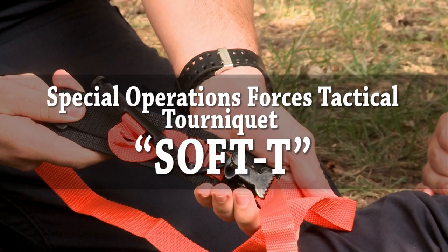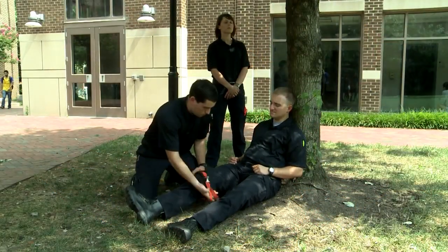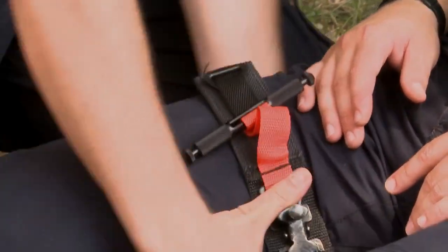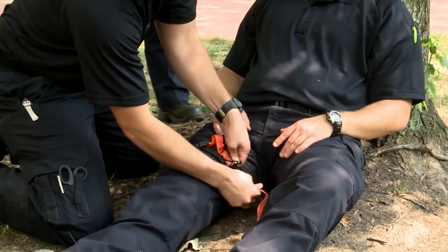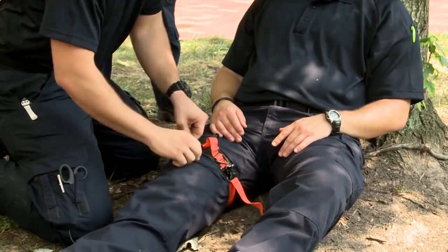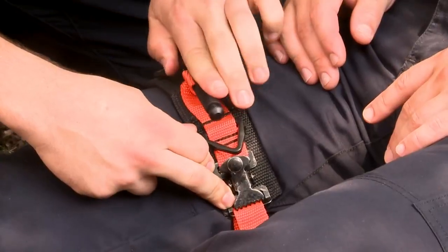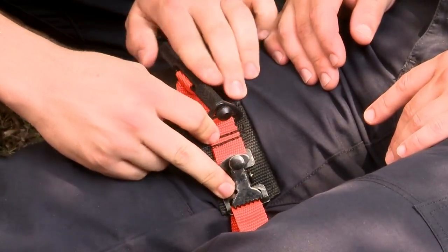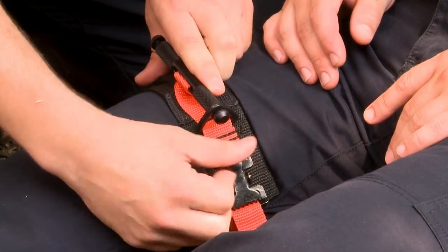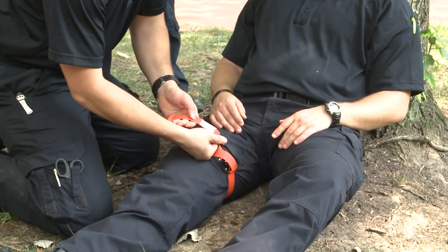The Special Operations Forces Tactical Tourniquet, or Soft T, is best looped around the arm or leg. If unable, the strap can be pulled through the buckle and re-threaded. Hold the tourniquet platform and pull on the strap as tightly as possible to remove as much slack as possible. Twist the tourniquet handle until all blood stops flowing from the wound. Secure the handle into the tri-ring and secure the buckle screw to prevent slippage. Document the date and time the tourniquet was applied at the end of the strap.